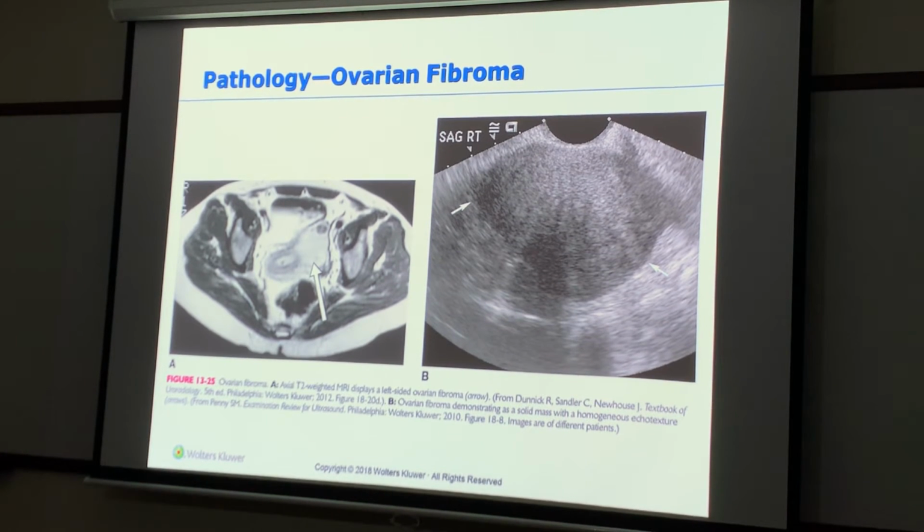Can we do cine loop? If the doctor's not there, absolutely do a cine loop. Okay? If your doctor's there, you can take a cine loop if you want to get into that habit. It's not required. Okay. But if the doctor's not there, absolutely do a cine loop.